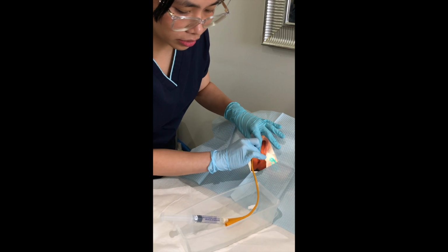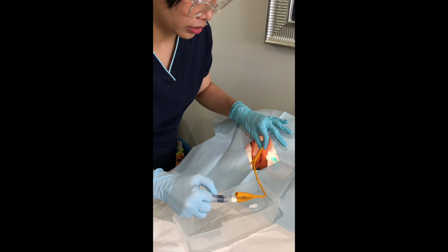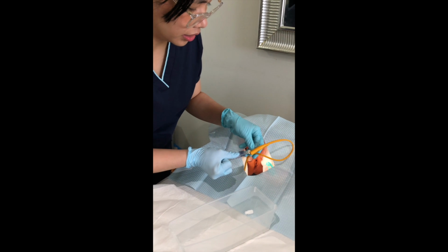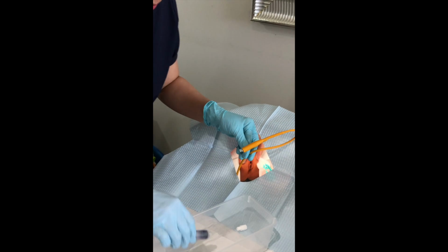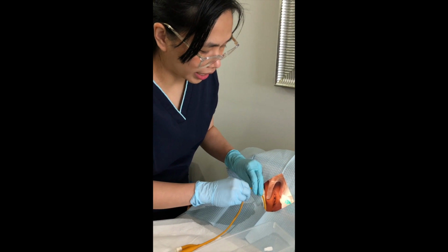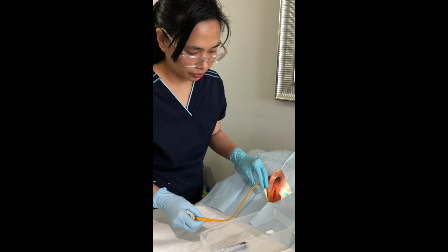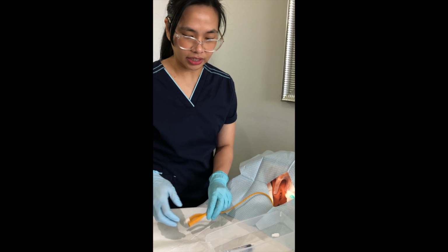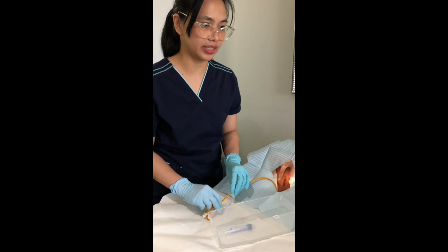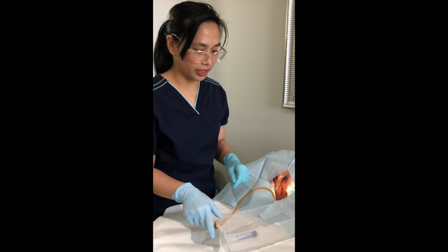You can now inflate the balloon. Okay, once you've inflated the balloon, you can just take it out and then put the bag lower than the patient, and just gently tug the catheter until there's a resistance, and then the balloon is inside the patient. So once you have done that, you can secure the bag onto the patient's leg, and then you can now dispose everything.